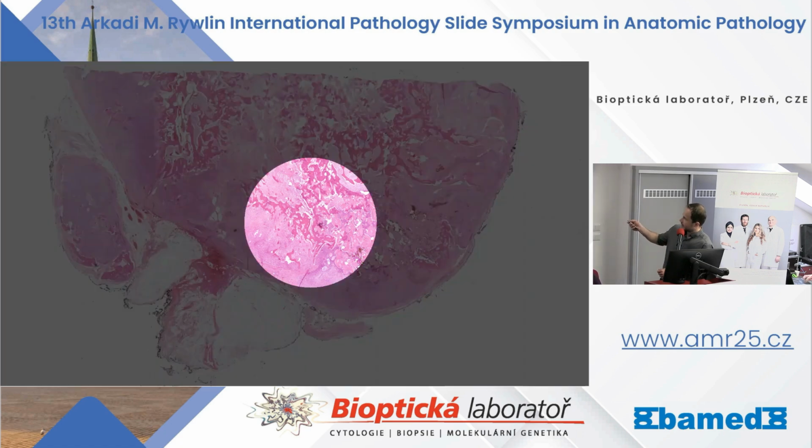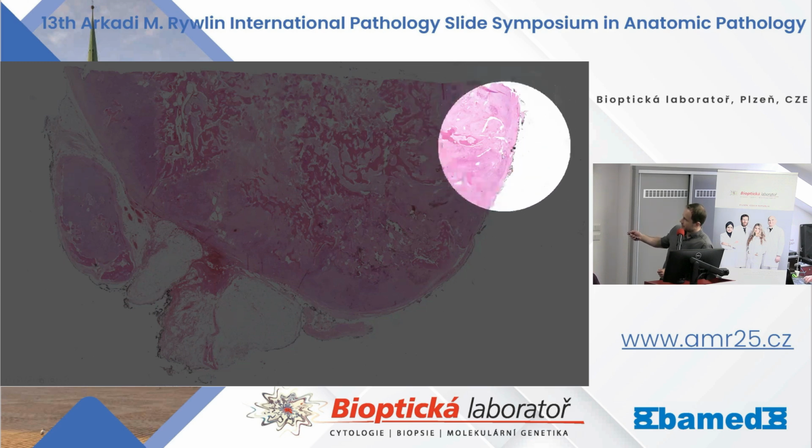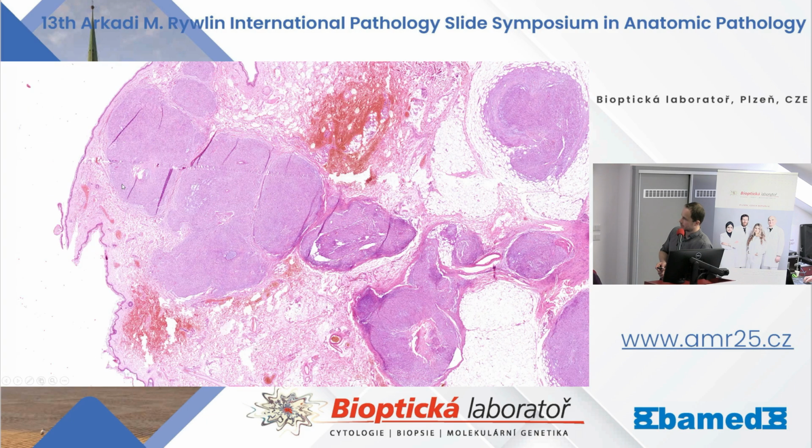And again, this is a different slide from a different block. Very thick fibrous pseudocapsule, which is a very helpful diagnostic clue. Another section shows again multinodularity.